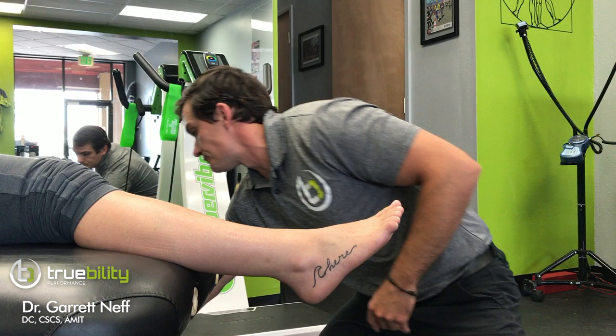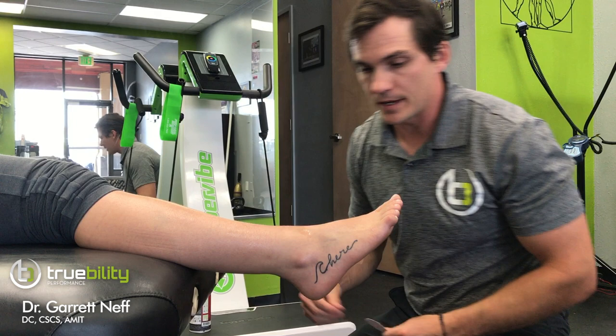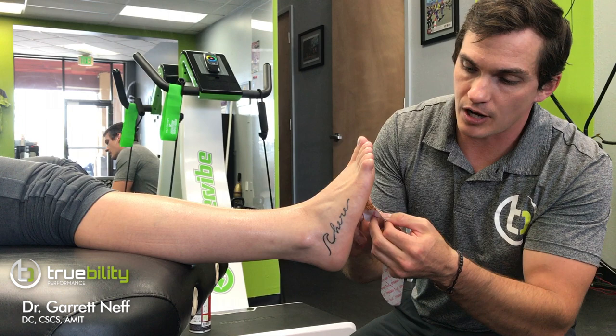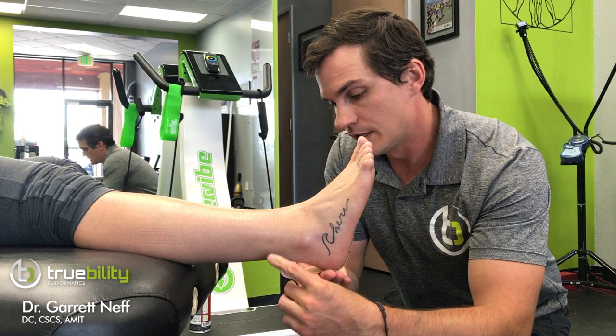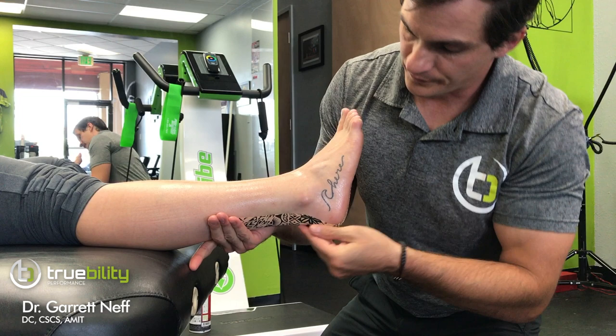The first thing I always like to do is use a little pre-spray, catching everywhere the tape is going to make contact. For the first line of tape, I'm going to start in the mid arch — I'll go kind of short for the video — and just cover the fascia itself, then follow through the heel. I'm going to create a little pull and tension, wrapping around the lateral side of the Achilles and coming up the calf a little more lateral.